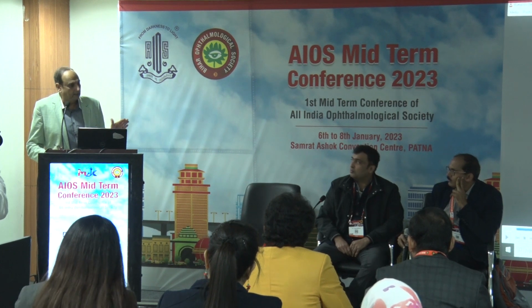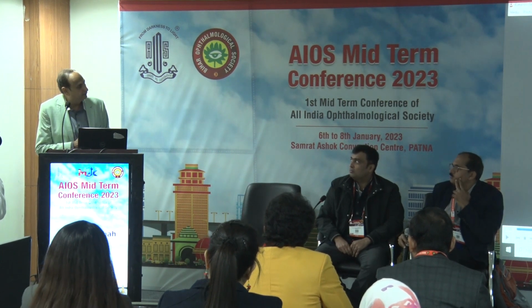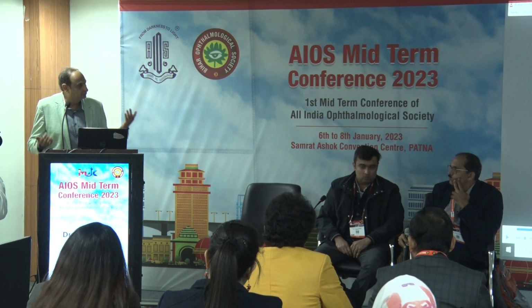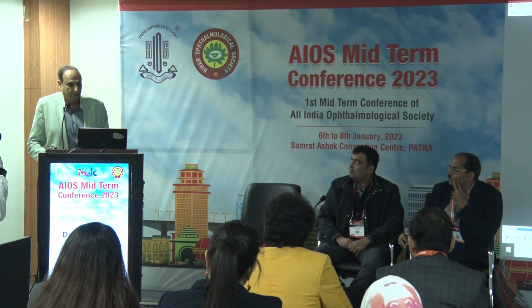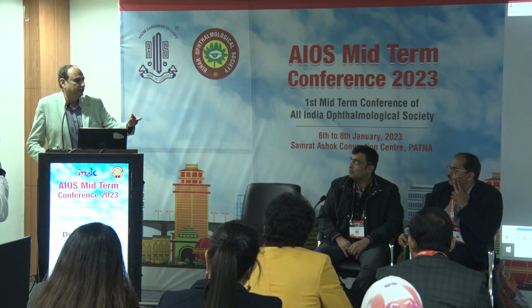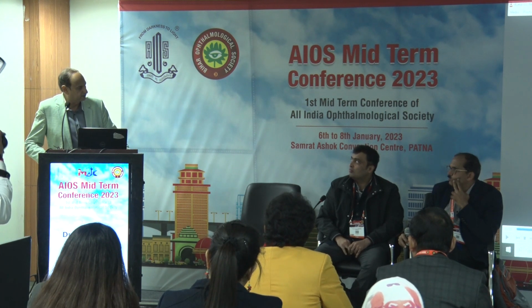I would say in the last 5 years we have explanted none, and whatever we explanted was very early on. But we are very strict in our regimen and choosing the patients. Any outliers, and we try to dissuade them from a phakic IOL. Somehow we have become more mature, but none in the last 5 years. And like the patient of cataract, he developed this cataract after 9 years.